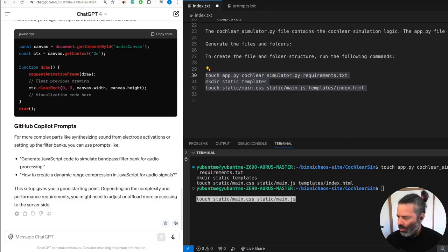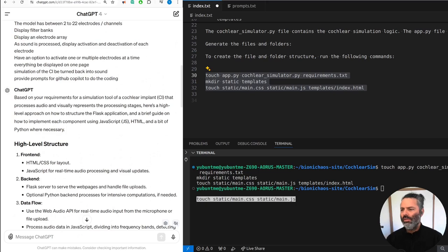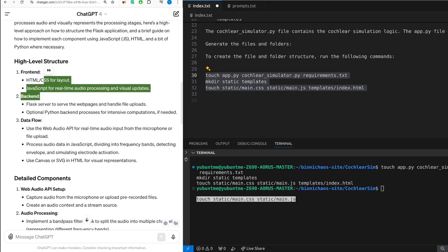Based on your requirements, for a simulation tool of a cochlear implant (CI) that processes audio and visually represents the processing stages, here's a high-level approach on how to structure the Flask application and a brief guide on how to implement each component using JavaScript, HTML, and a bit of Python where necessary. High-level structure: 1. Front-end: HTML and CSS for layout, JavaScript for real-time audio processing and visual updates. 2. Back-end: Flask server to serve the web pages and handle file uploads. Optional Python backend processes for intensive computations if needed. 3. Data flow: use the Web Audio API for real-time audio input from the microphone or file upload. Process audio data in JavaScript, dividing into frequency bands, detecting the envelope, and simulating electrode activation. Use Canvas or SVG in HTML for visual representations.